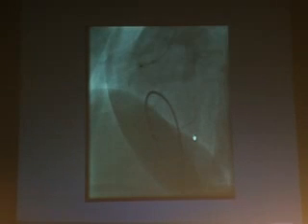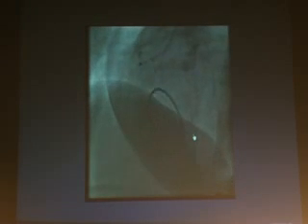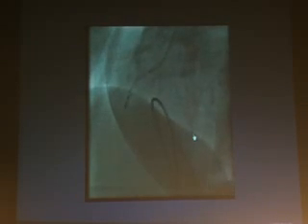So we decided to do a rotablation. We took a 1.5 millimeter burr at the recommended speed and started doing rotablation. With the pecking movement in the mid RCA, we negotiated the tightest point and gave a polishing to and fro run. Everything went very easy as of now.